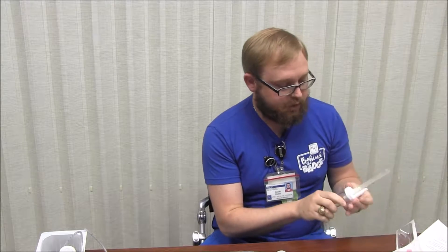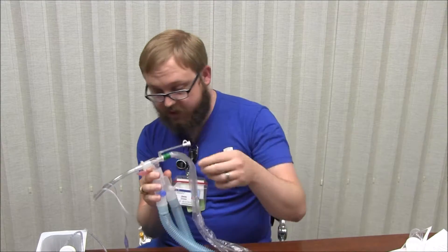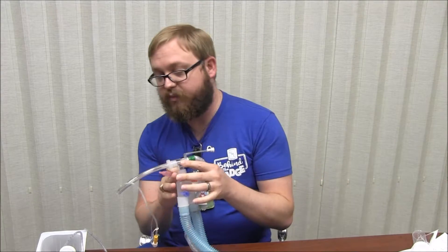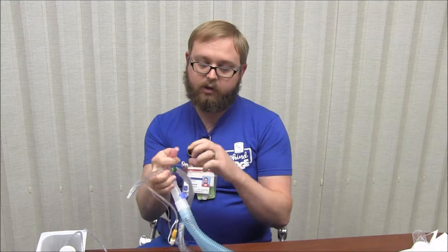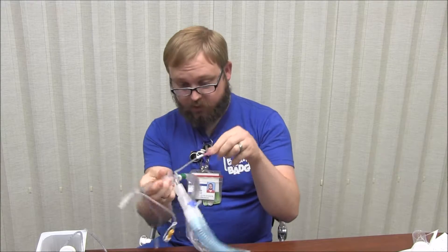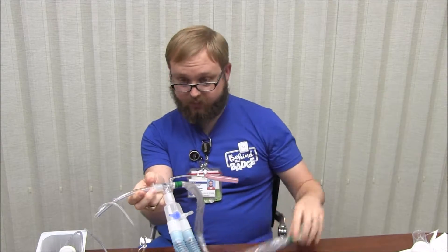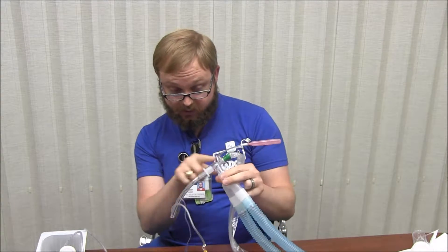We're also going to be limiting the amount of saline that you're using for your patient. If you have a little bit of thick secretions, you absolutely can use saline — it does not hurt your sample. But we're going to limit the amount that actually goes into the patient's lungs. If you have a thick amount, you can put on your pinky the pink bullet and then get your sample the rest of the way.